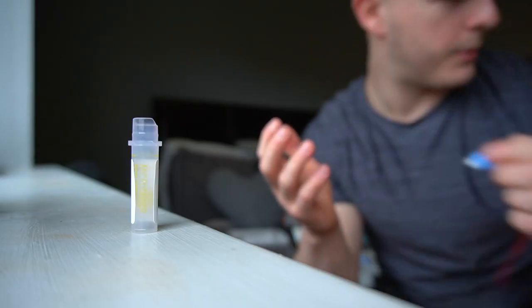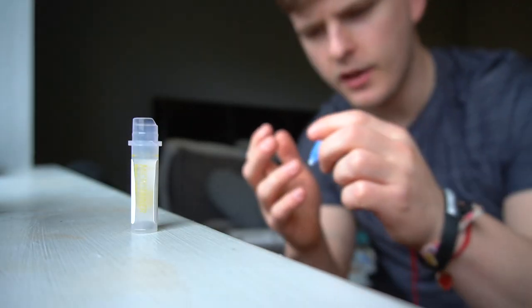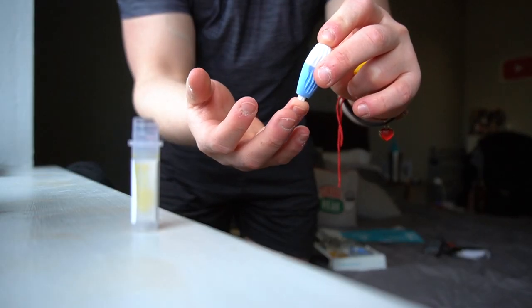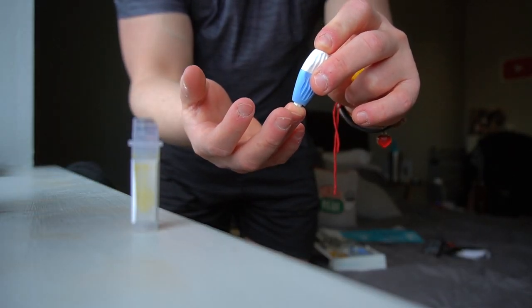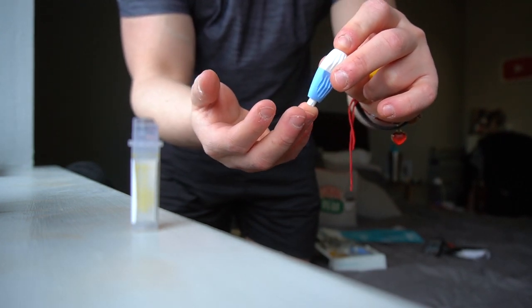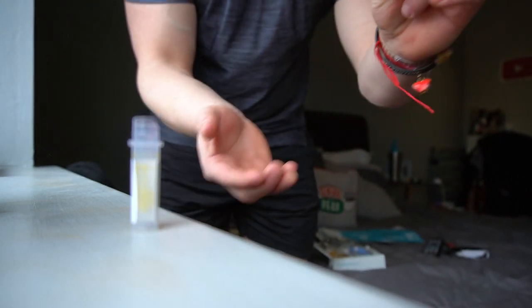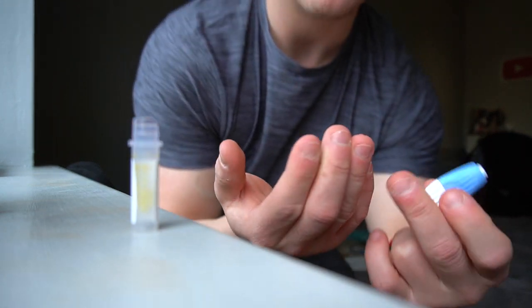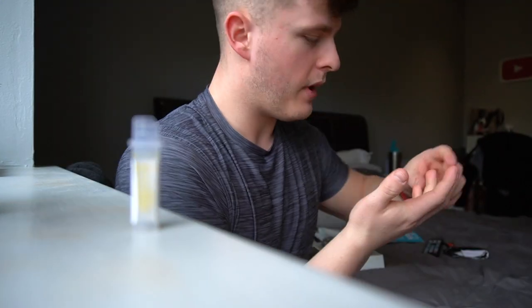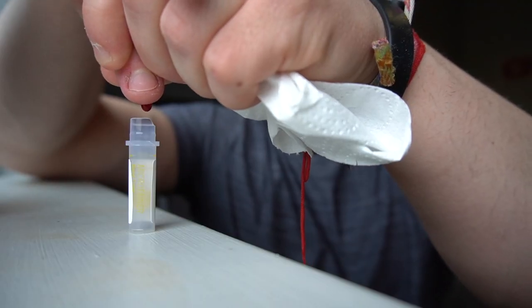Number four: pierce the skin. Before we do that, let's actually open the tube so that I don't miss. I'm a little bit nervous, to be honest. Do you pierce right at the top? Do you pierce halfway down? Press down firmly — okay. How firmly? Oh yeah. That made me jump. That wasn't that bad, though. Wipe away the first bit. There it is.